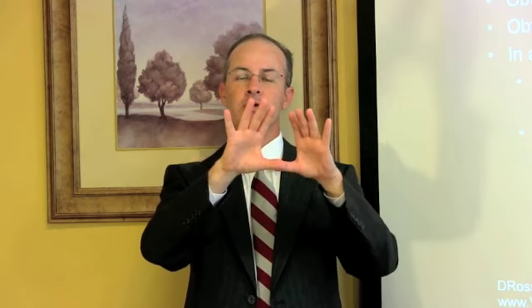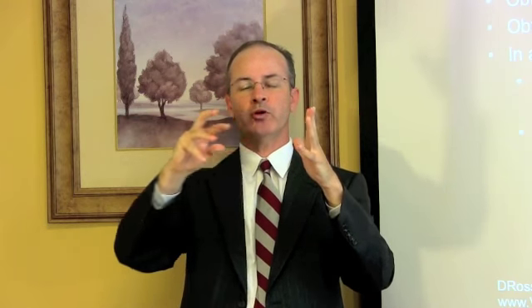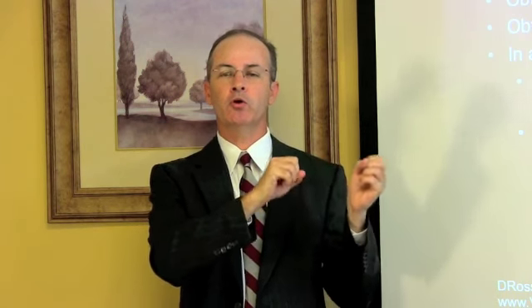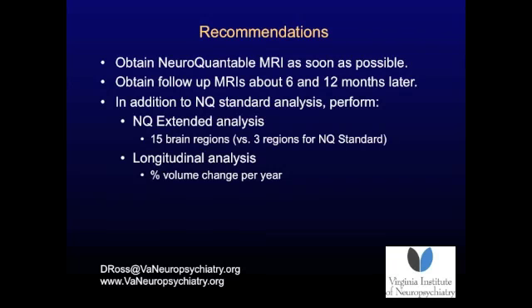And so by measuring the brain atrophy, brain volume after the accident, if we find progressive brain atrophy after an accident, in many cases that would be unlikely related to a brain problem which happened many years before, particularly if that pre-accident brain problem is fully resolved, or would not be likely to cause progressive atrophy years later.